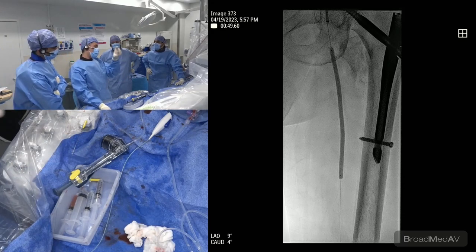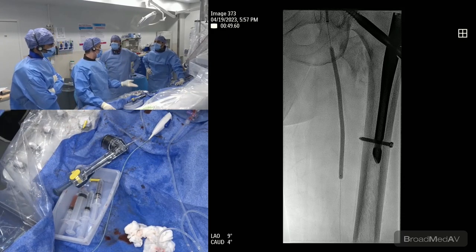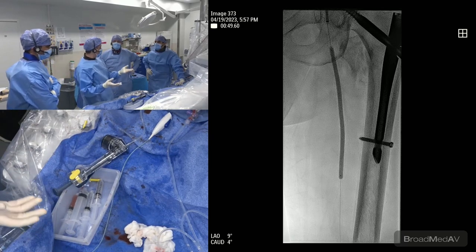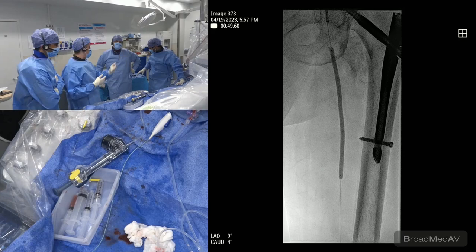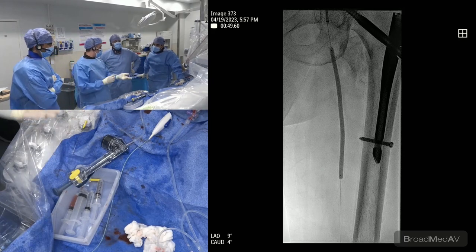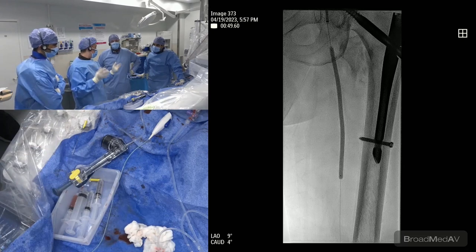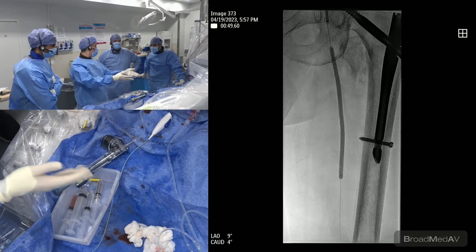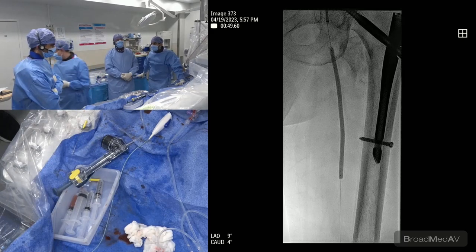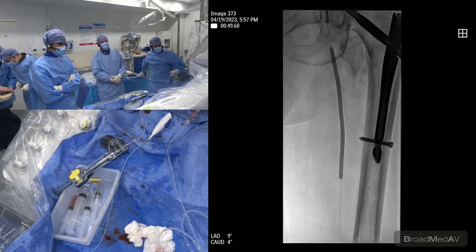Vishal? Yeah. So I would have run the other way. I would have ballooned the way we've done it, and then if you have to, we would probably spot stent if I find any flow-limiting dissection. Again, like PK talked about, if it's not a complex dissection, if it's a non-flow-limiting lesion with a length of 150, I would not put a 150 length scaffold, or 140 if Zilver comes in 140 length scaffolds. But do a DCB with patency rate, let the wound heal, and then, of course, you evaluate the patient clinically and by ultrasound.